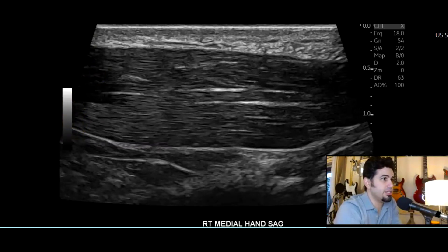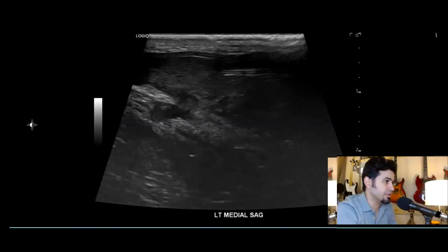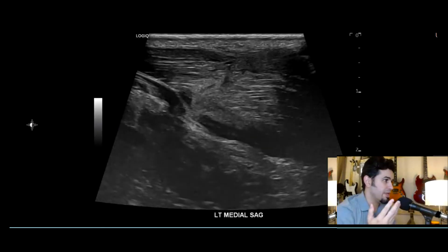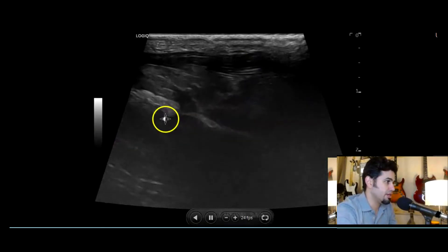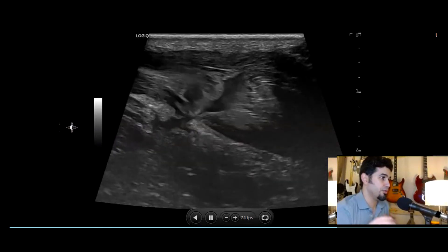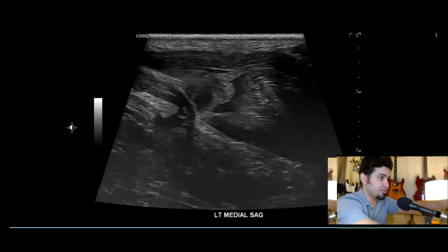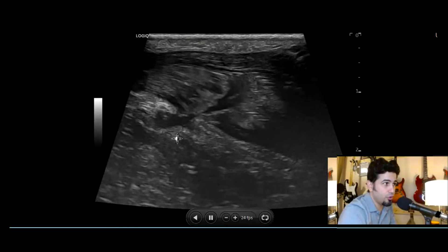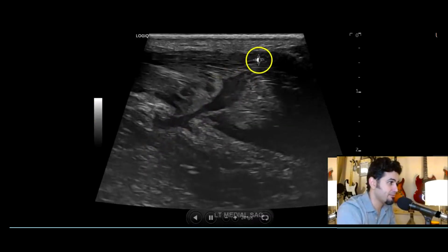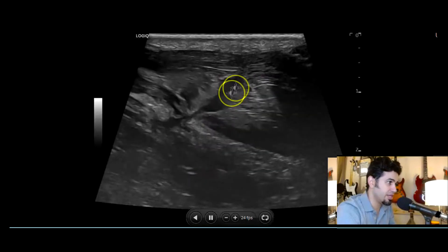Here's where you really see the extent of the damage in the dynamic views. Here's just a sweep through from lateral to medial — you can see the defect right there and the fluid collection. Now here's with abduction of the pinky — the patient was not able to perform this himself — and you can see the separation of the two muscles very clearly. This is with the 24 megahertz transducer on the LOGIQ E10, just fantastic imaging.